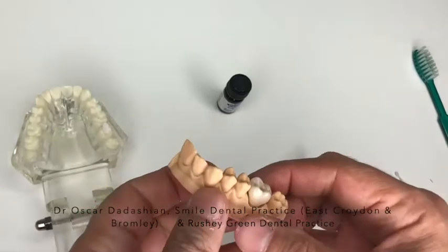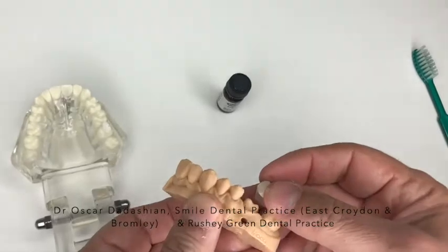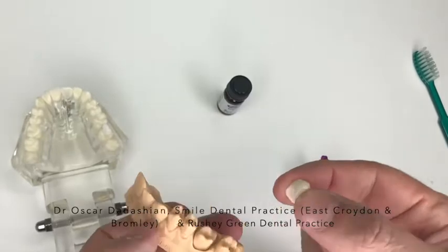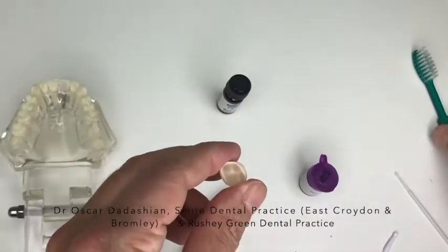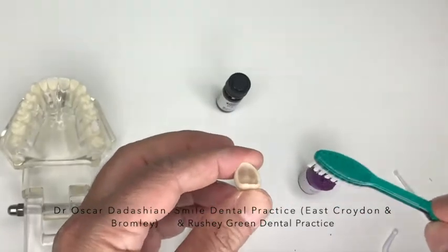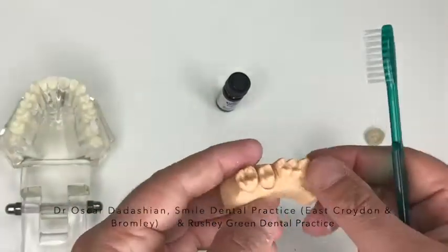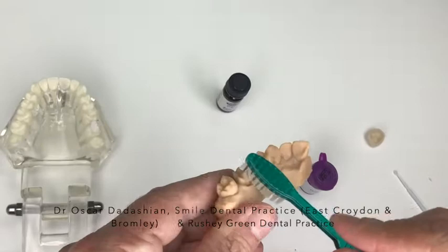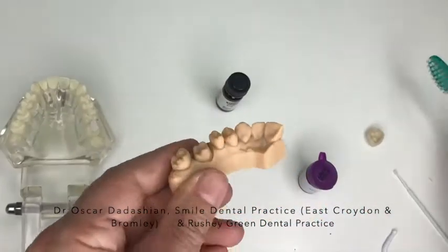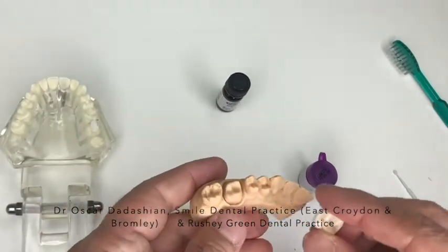So let's say you have a crown that has come out, and you want to put it back in temporarily. First of all, you take your toothbrush and you clean the inside of the crown very gently. Make sure all the debris and all the remaining food comes out and it's nice and clean. Take your toothbrush and very gently clean the tooth too. Obviously the tooth is going to feel a bit sensitive. That's perfectly fine. Just do it nice and gently.